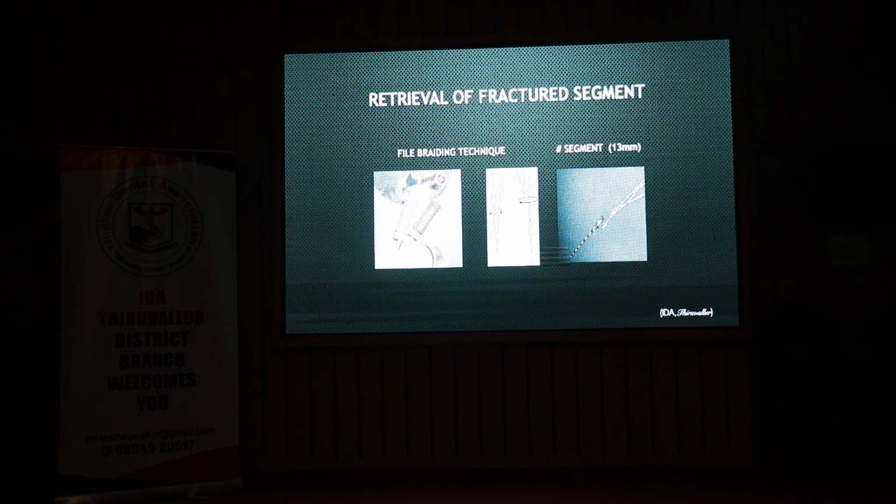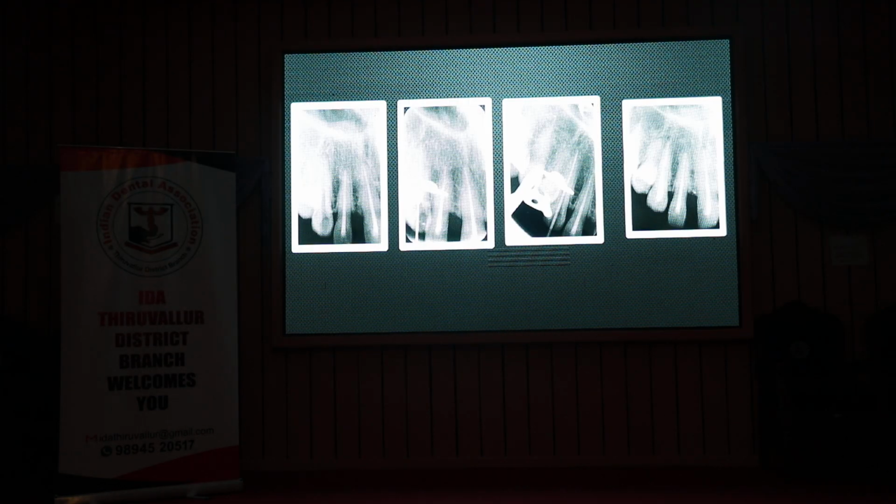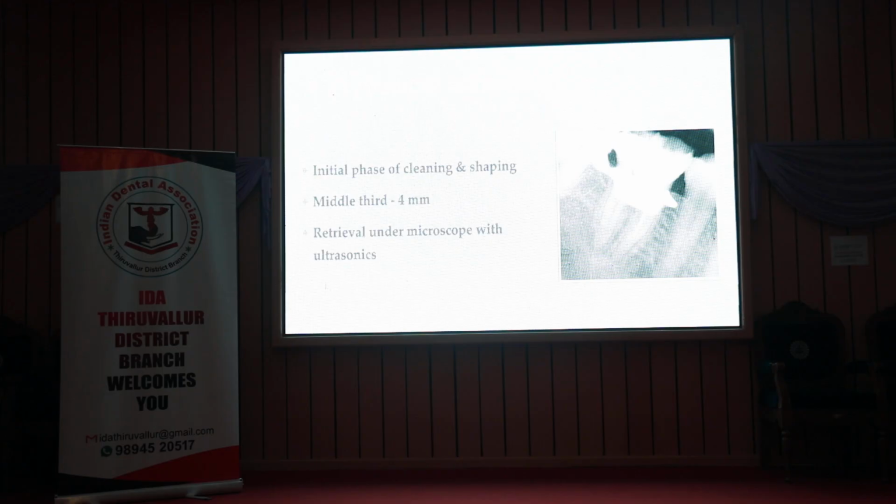If you don't have any of those specialized instruments, if it is in the anterior teeth and if it is a large canal, you can still try this. So H files definitely are there in your armamentarium. Only thing, you will have to use new H files. Don't use the older ones. So this is the case after removing.